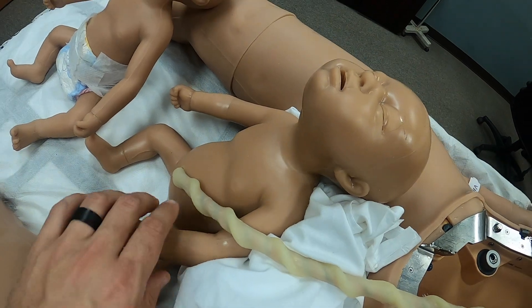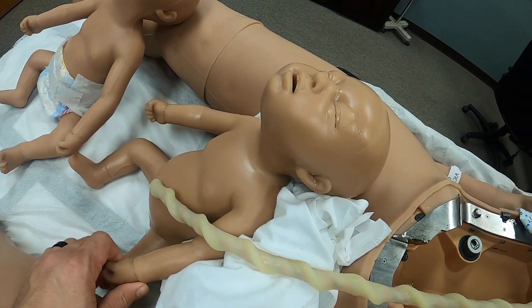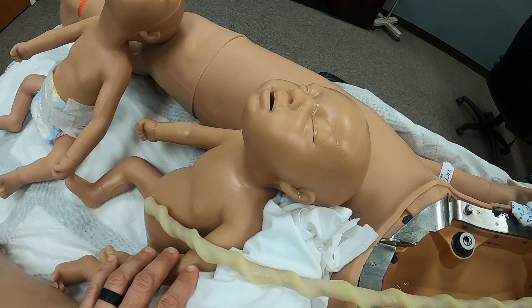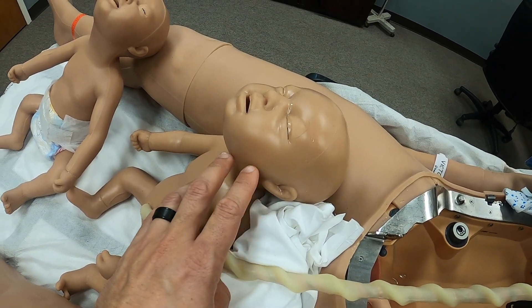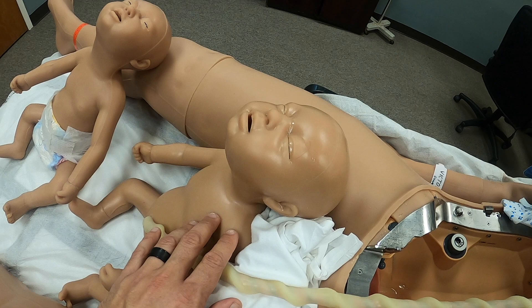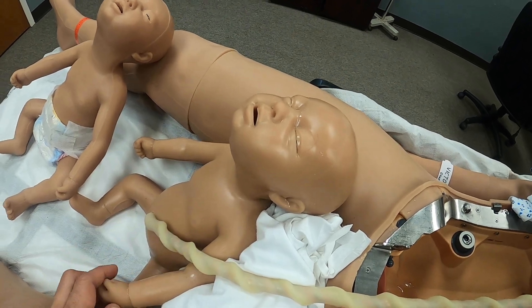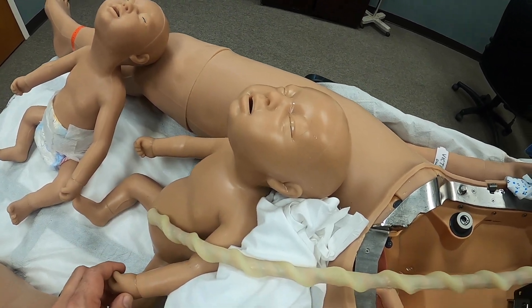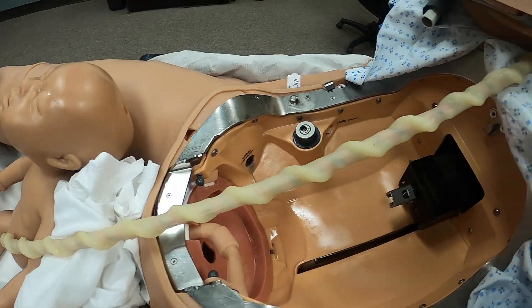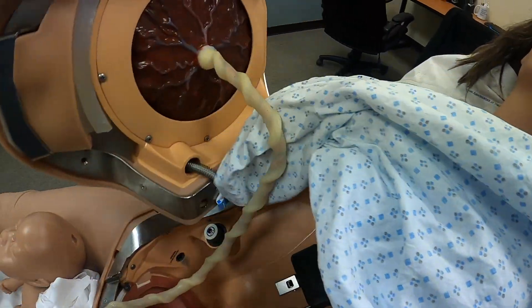Once the baby is delivered, we pre-program this mannequin so it will run a simulation. Students are able to get their APGAR scales both right after delivery and then at five minutes, working their way through the delivery as well.